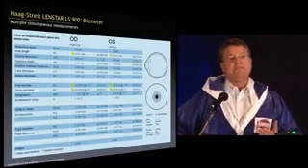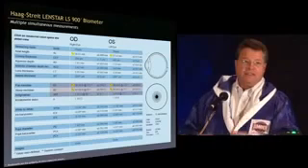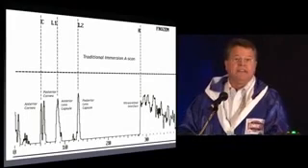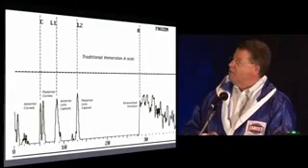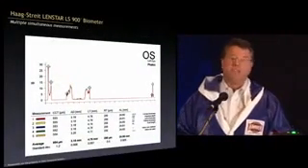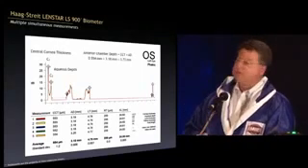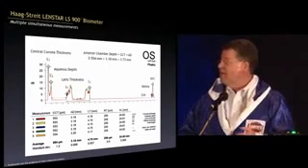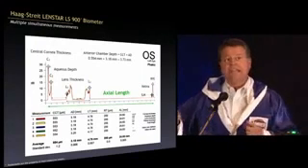Now you get a tremendous amount of information. This is with one button push for each eye. This is what you get, and these are just the Ks right here. Okay, so we all know what this is. This is an immersion A scan: anterior cornea, posterior cornea, anterior lens capsule, posterior lens capsule, vitreoretinal interface. Well, with the LENSTAR, what it does is it gives you that information looking just like an immersion A scan. So there's your cornea, and of course you get your central corneal thickness, you get your aqueous depth, lens thickness, you get to see the internal limiting membrane and the RPE of the retina added all together, and that gives you the axial length. So it's a huge amount of information, and you have access to every single part of this.